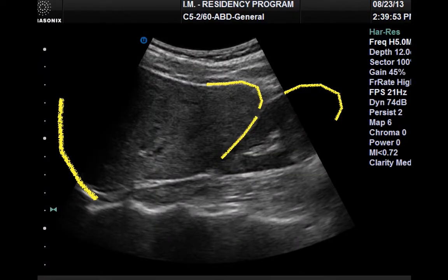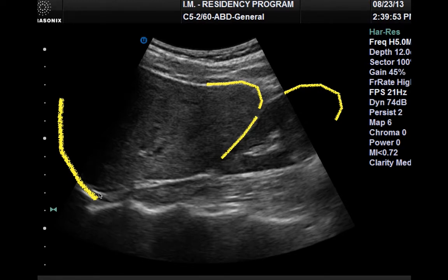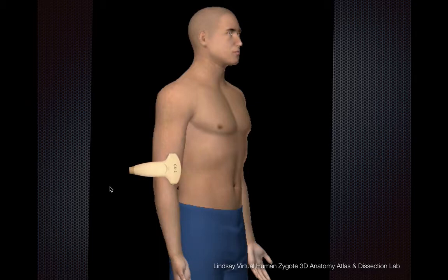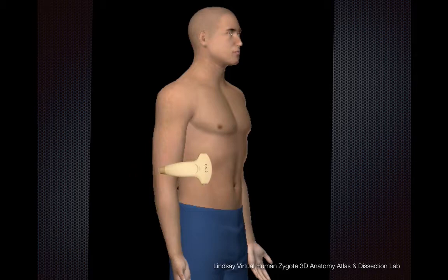Where would fluid hide out? One of the more sensitive spots for fluid to accumulate is at the tip of the liver. Morrison's pouch is another area where fluid can accumulate. You should also look at the inferior pole of the kidney as well as above the liver just beneath the diaphragm. Because it's a 3D structure, performing just one slice isn't sensitive enough — you should sweep or fan through the entire area in the right upper quadrant, covering from anterior to posterior, to fully interrogate the hepatorenal space.